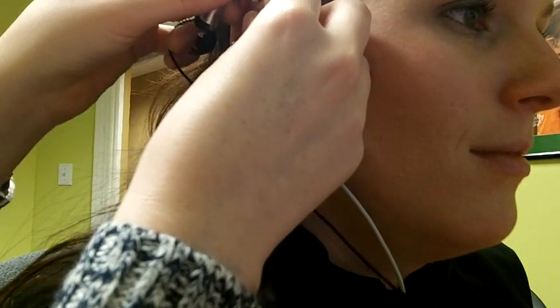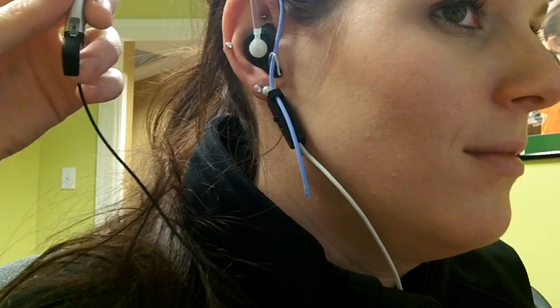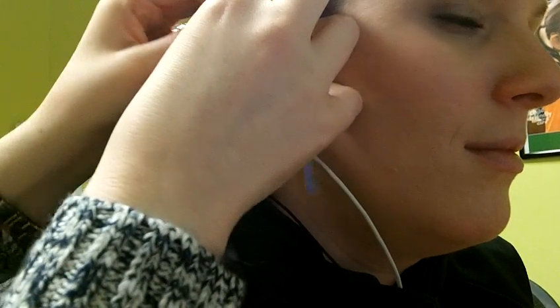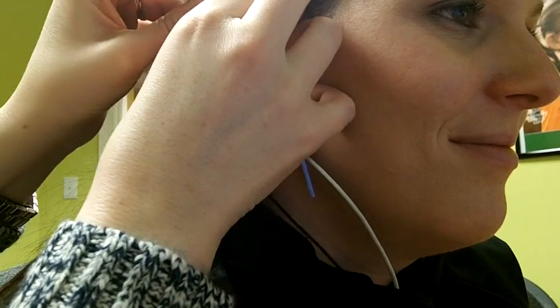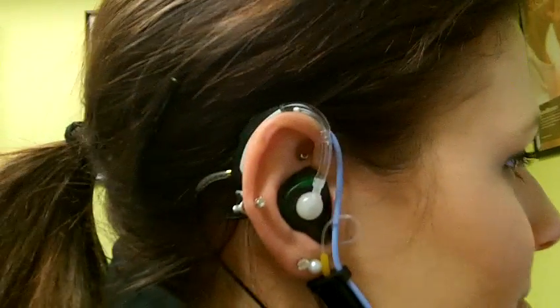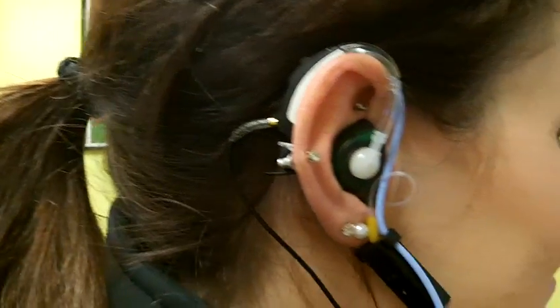So we're going to attach it right in here, just like so. Hang it over her ear. So now we're all attached. We've still got the probe tube in the ear and the rest of the probe microphone hanging over her ear.